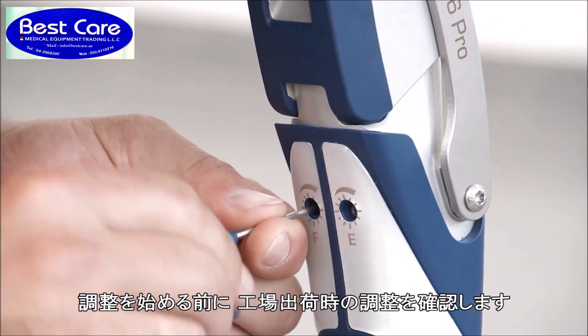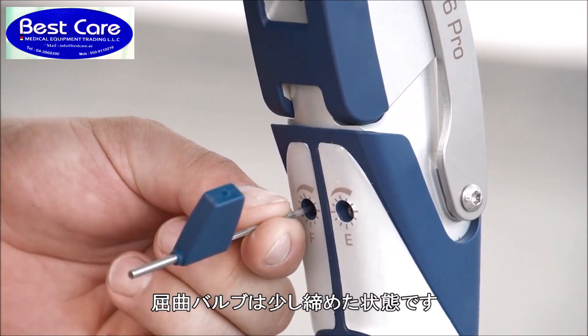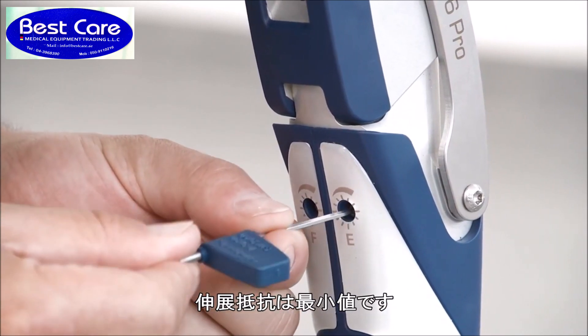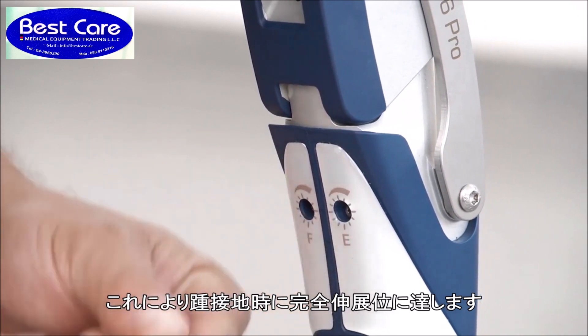The flexion and extension damping can be adjusted separately and individually. Before fitting the user, please check the factory settings. The flexion damping is set with the valve slightly closed, meaning it is turned two times to the right from the left-hand stop. The extension damping is set with the valve fully open so that the prosthesis is always in full extension at heel strike.